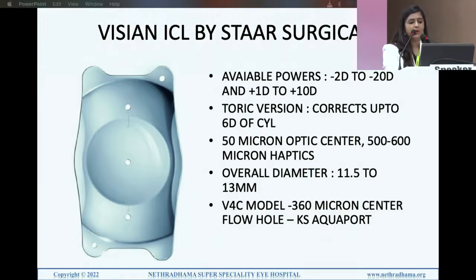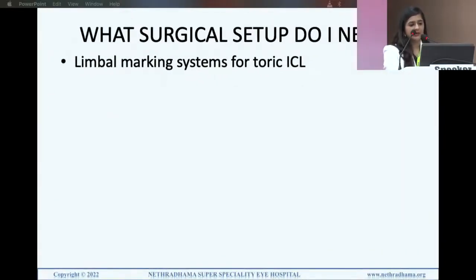And in the V4C model, you have a 360 micron center, the KS. Central hole, the KS aquaport.